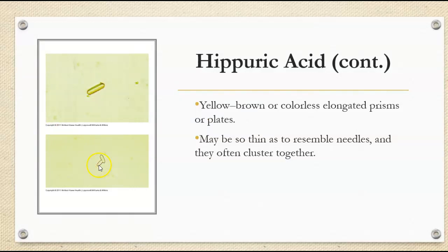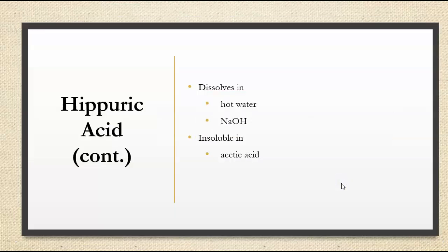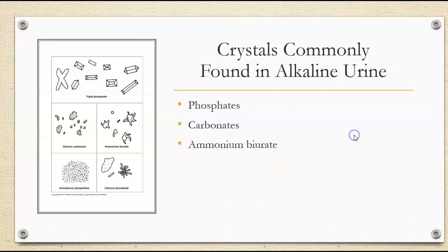So it kind of looks like this. A lot of the time you will encounter this, and you may just pass it off as a skin artifact. You won't really see anything that looks like this other than the one crystal. So it's not really common, and we don't really care. It'll dissolve in hot water and sodium hydroxide, and it's not soluble in acetic acid.